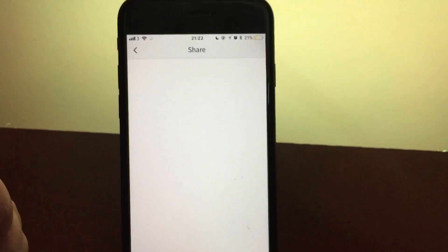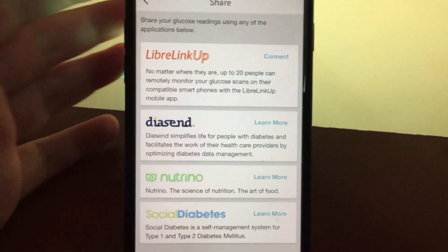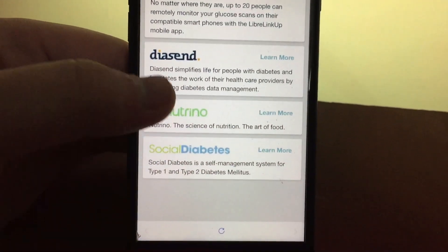Because it's on your phone, you are also able to upload your data to different platforms. One thing you can upload your readings to is Diasend, which is a diabetes cloud management platform. My diabetes clinic uses it, so when I scan my Freestyle Libre sensor, the readings automatically send to Diasend and my nurse or endocrinologist can access it automatically.